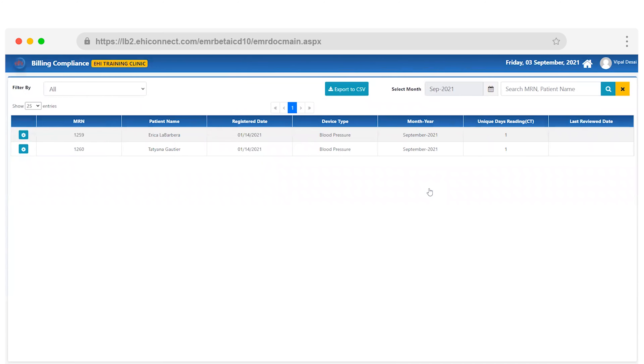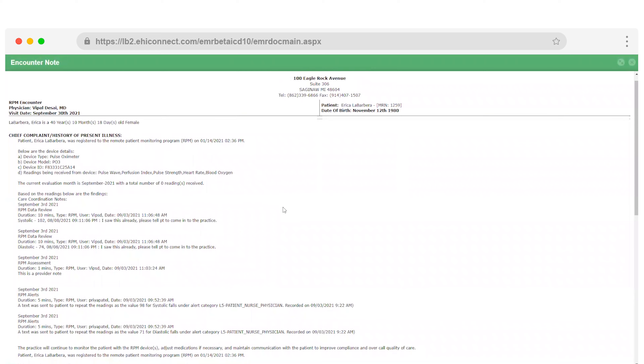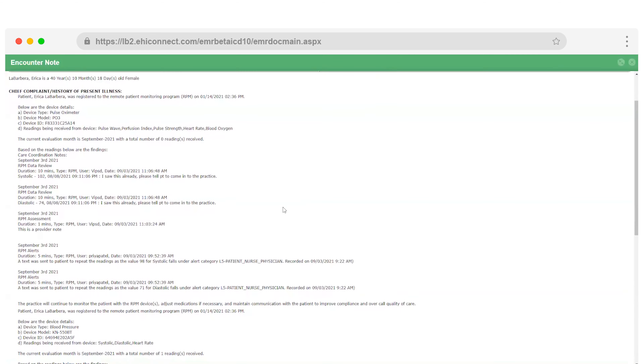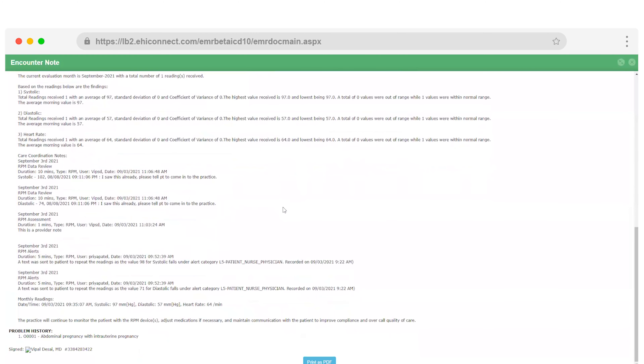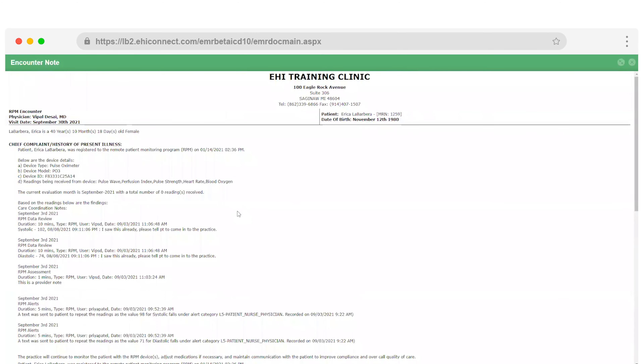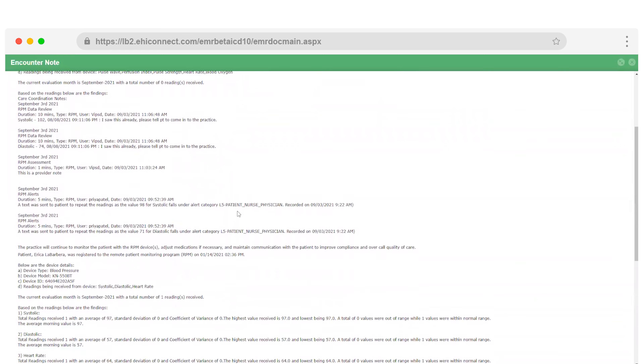You can also create super bills right here and send out a claim. What's great about our application is that it automatically creates encounter notes based on a patient's RPM chart notes and number of monthly readings. Our remote patient monitoring solution is simple. We created a seamless way to integrate this program into your workflow, so the only thing that changes is an improvement to your patient's health.